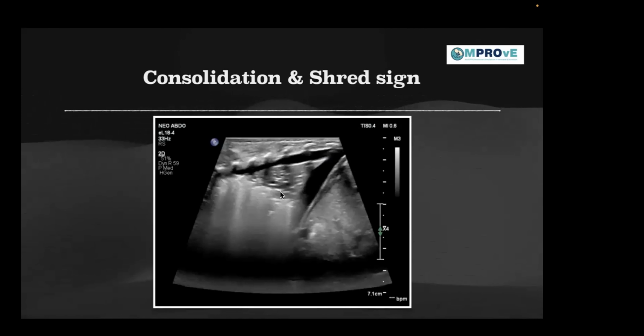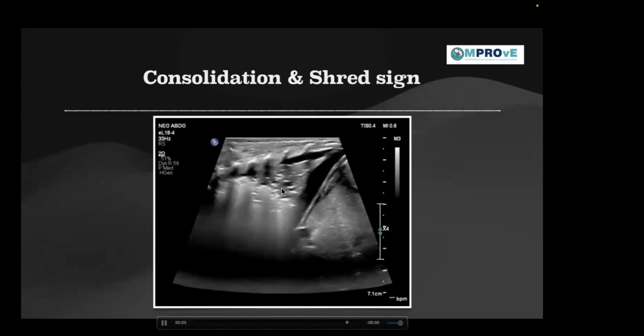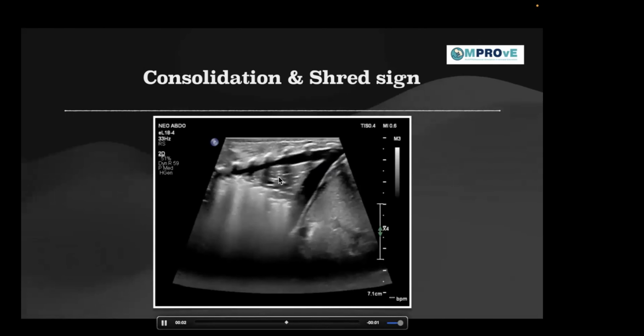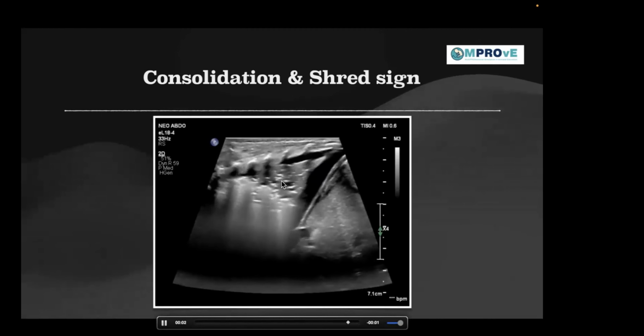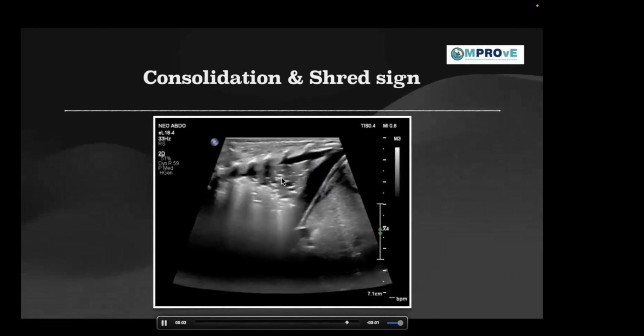And this is one of the conditions where you have this pleural effusion. That is the time when you actually see the lung. Otherwise, you never see the lung. You always see the pleural line. So what we are seeing here are fluid-filled air bronchograms. These black areas surrounded by the white packs, these are the fluid bronchograms.